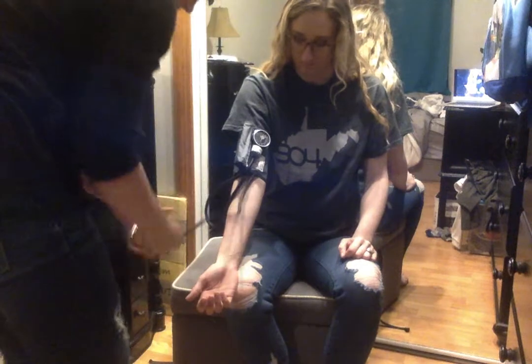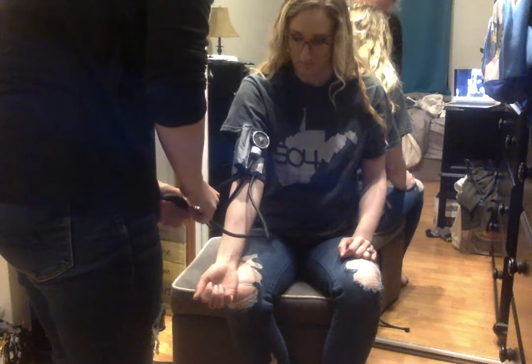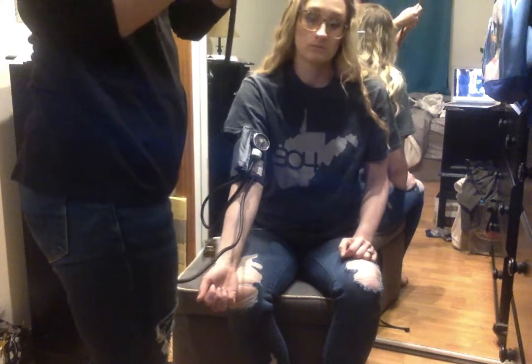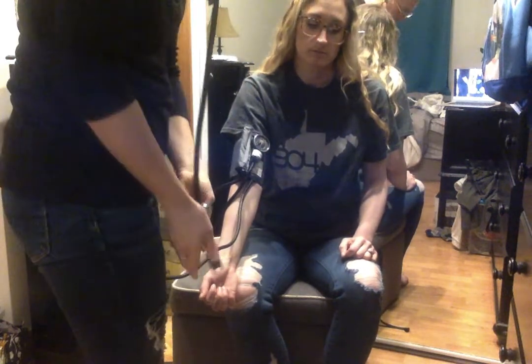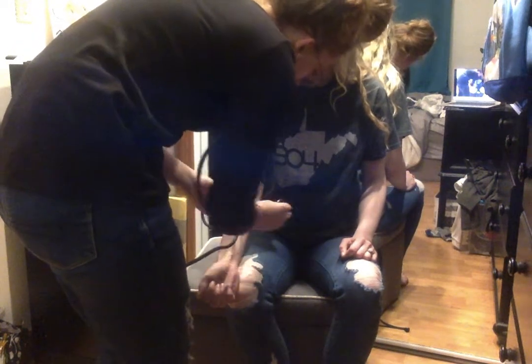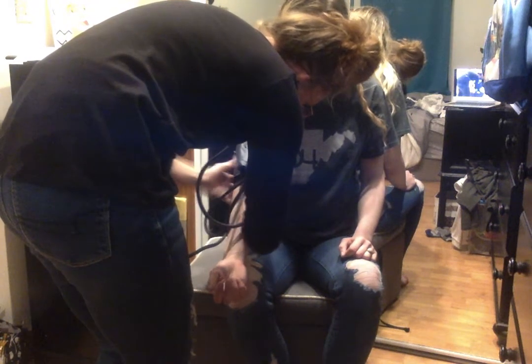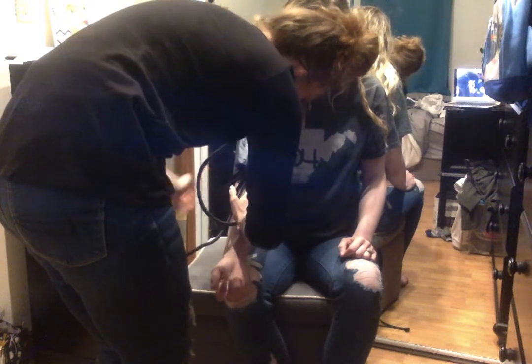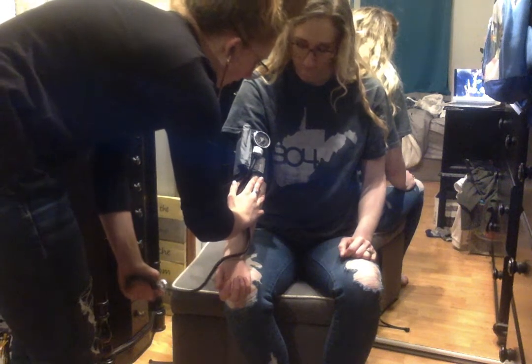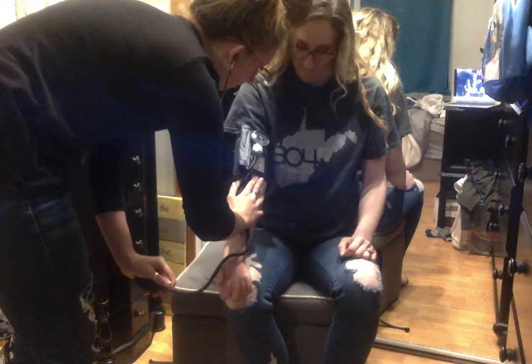And then I'm going to make sure that my cuff is right. Yep. And find the brachial pulse with the stethoscope. And inflate the cuff to about 140 millimeters. And slowly deflate.